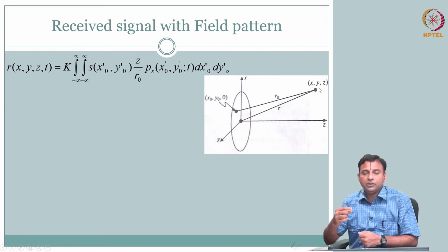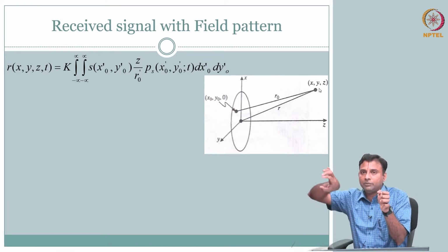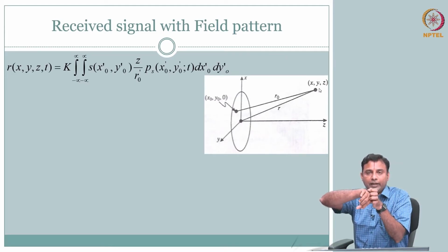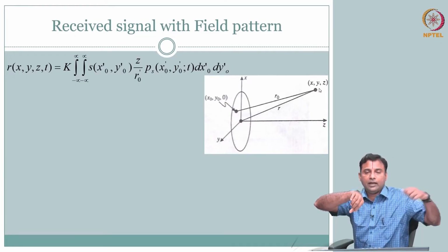A spherical wave comes. This is my transducer face, and this is my spherical wave, for example. When it comes and hits the crystal back on the receive side, it is going to now oscillate and then convert to electrical.